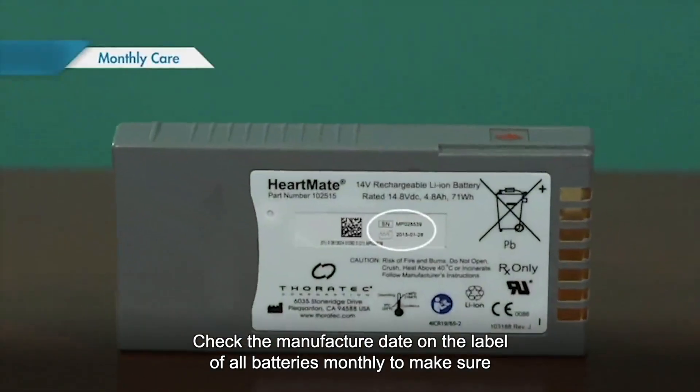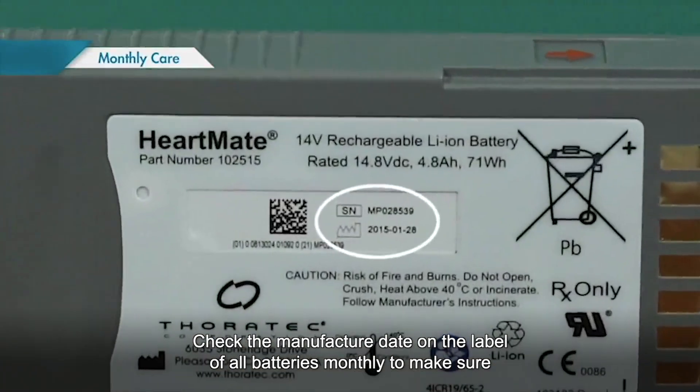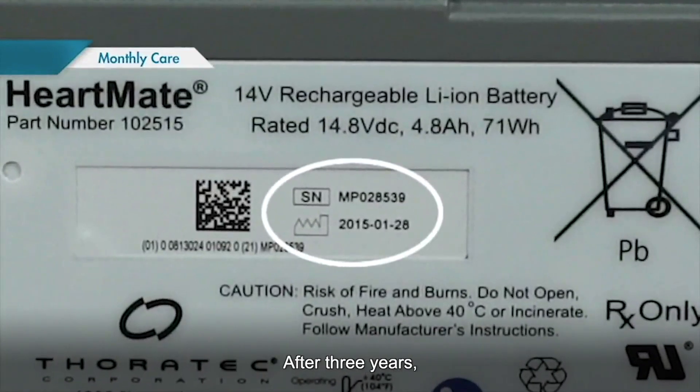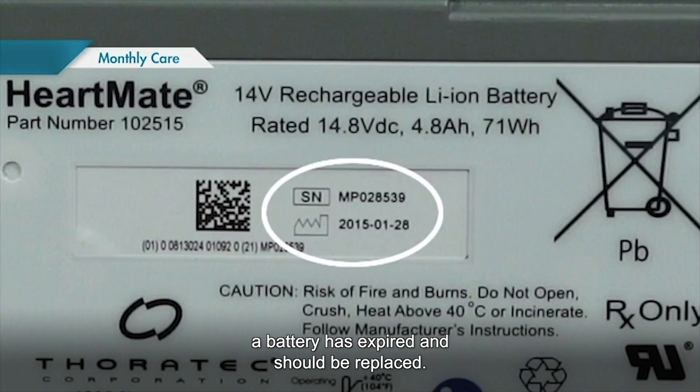Check the manufacture date on the label of all batteries monthly to make sure they are not older than three years. After three years, a battery has expired and should be replaced.